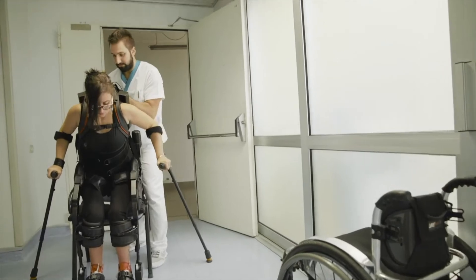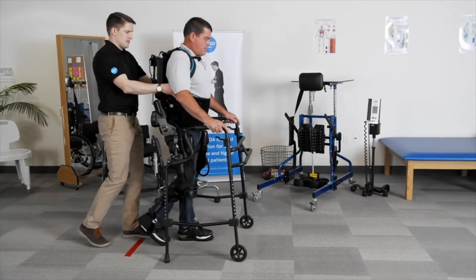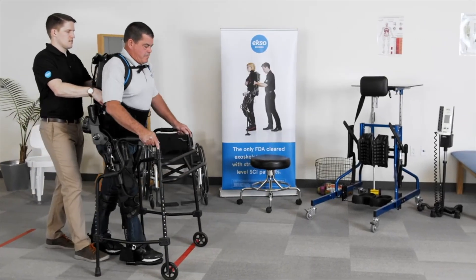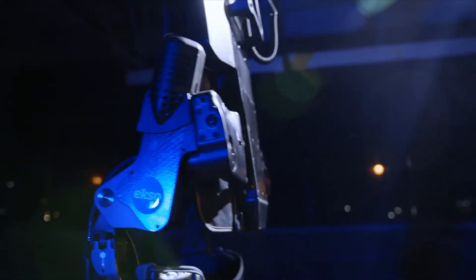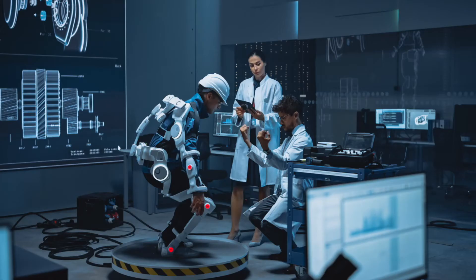ExoNR is another lower limb exoskeleton that helps patients to stand and walk. This exoskeleton is the first exoskeleton cleared by the US Food and Drug Administration, or FDA. It can treat patients after stroke, brain injuries, and spinal cord injuries to regain their mobility and normal gait to perform activities of daily living.